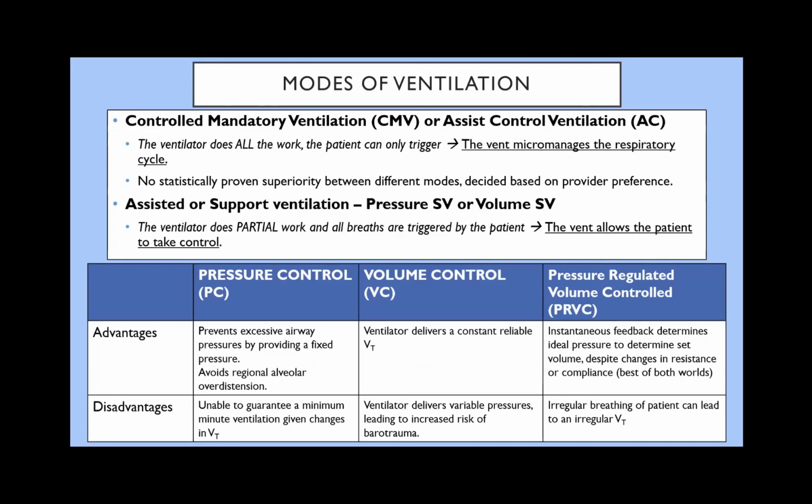Now, we're going to talk very quickly about modes of ventilation because I'm starting to run out of time, but the big brush that I want you to understand of mode of ventilation is that there are two broad types of mode. One, which is control mandatory ventilation, and the other one, which is assisted or support ventilation.